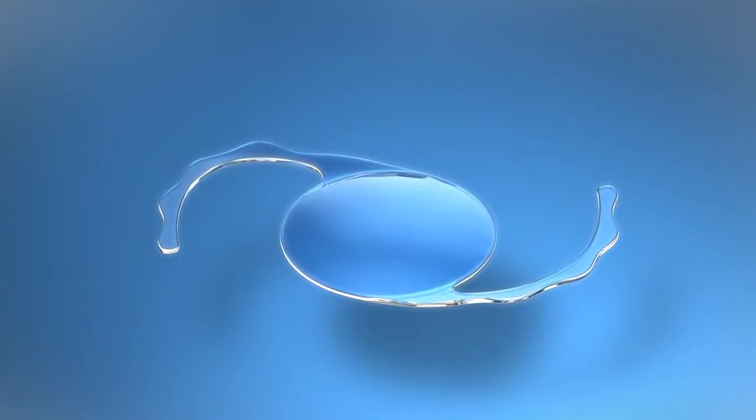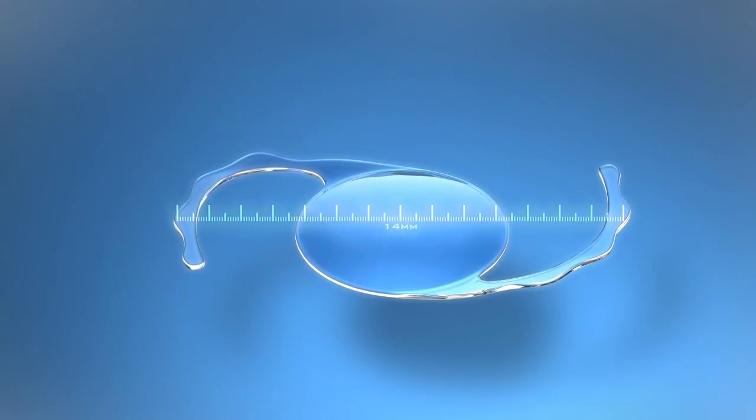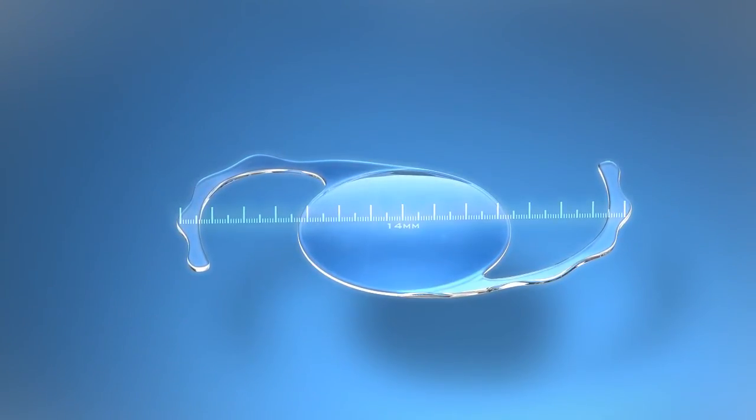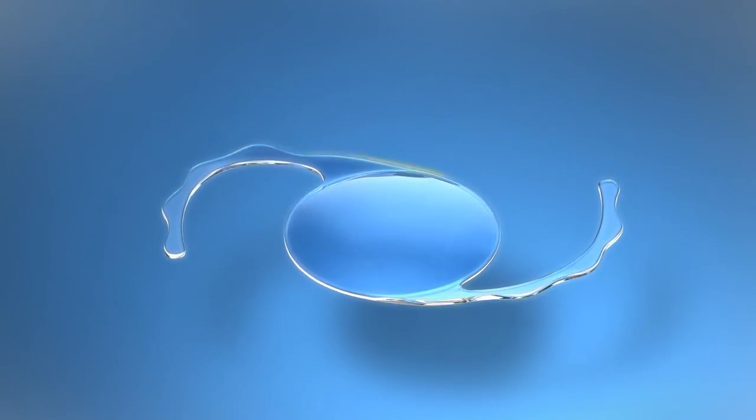both associated with the piggybacking of two biconvex lenses. The lens has a 14mm overall diameter to ensure secure, stable fixation in the ciliary sulcus. Undulations on the rounded haptic edges provide additional rotational stability.